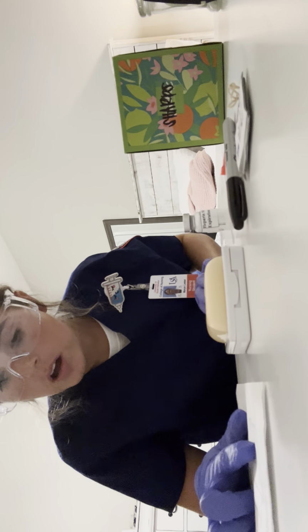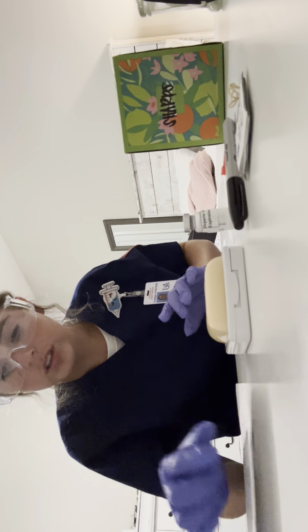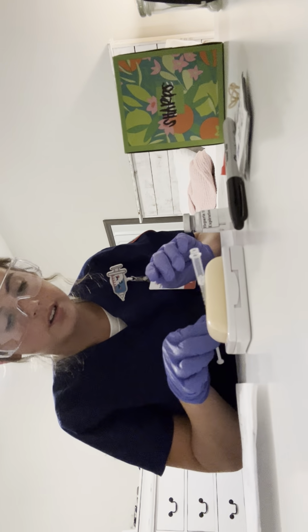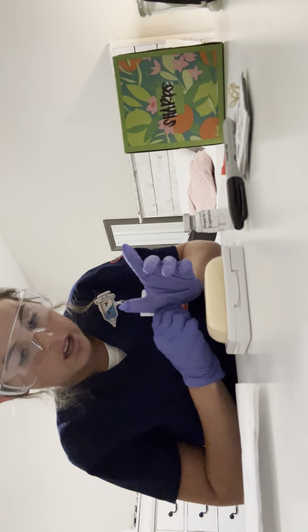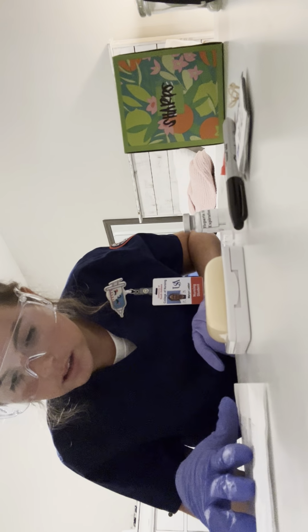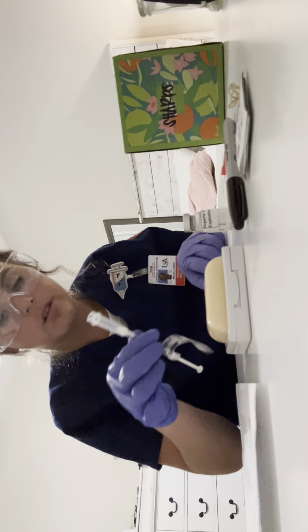Okay. Right dose, 5,000 units. We know we have the correct units. We have 5,000 units per milliliter. Okay. And we also have the right route, subcutaneously, and we know we have the right syringe.